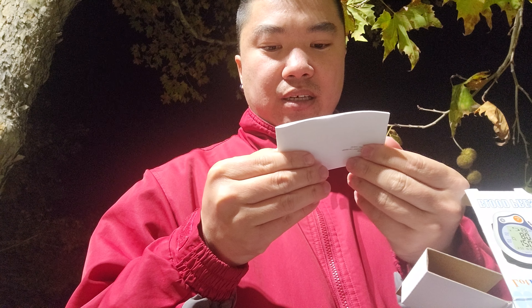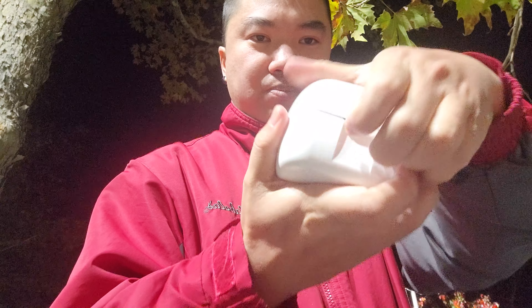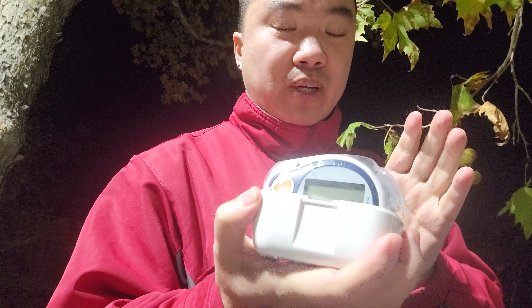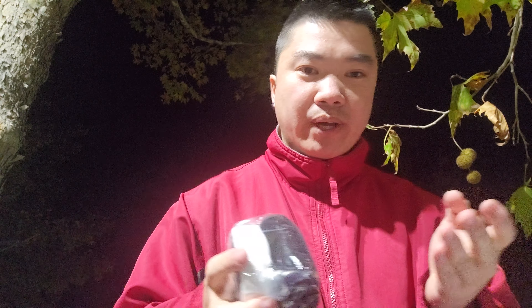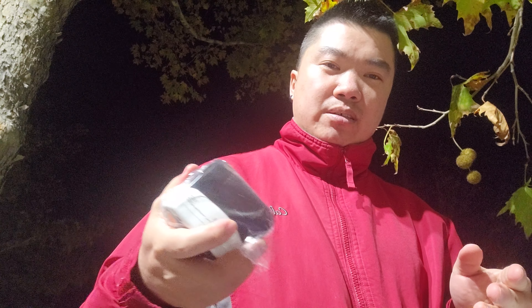I'm going to open this — I actually got this brand new, I haven't opened it yet. I probably bought this about a month and a half ago and just didn't have the time to open it. When you first open it, it has an instruction manual in English. It comes with a nice storage box for it.